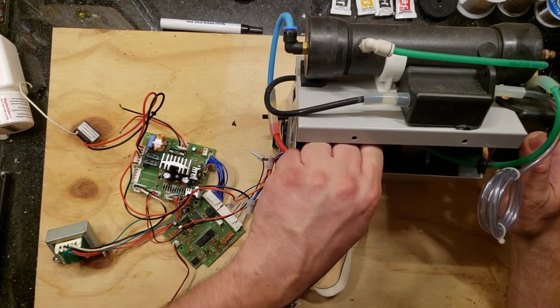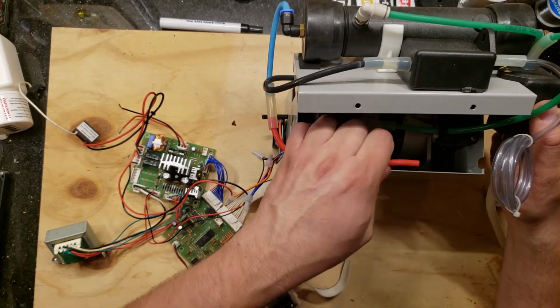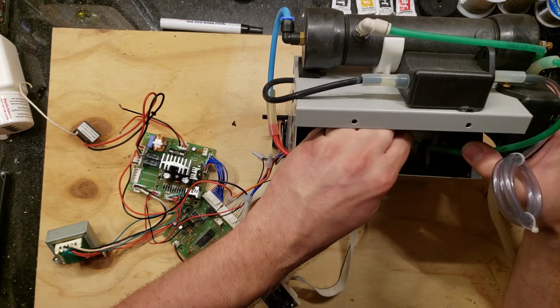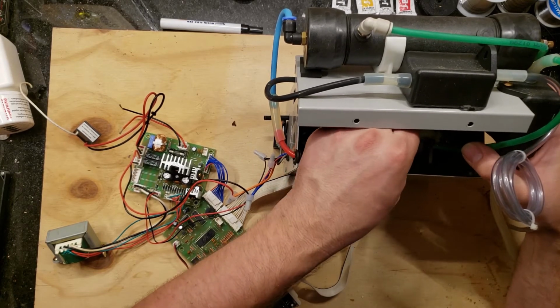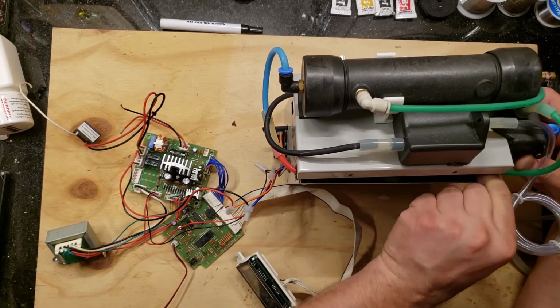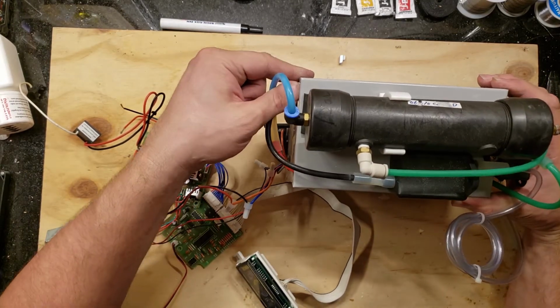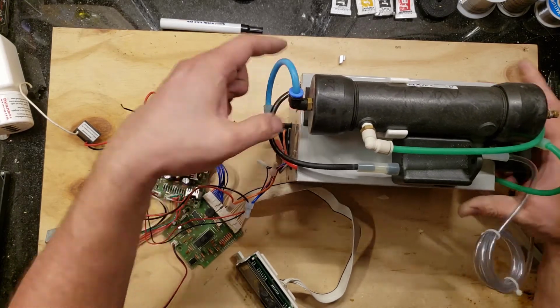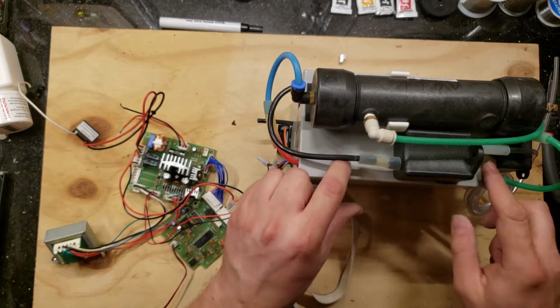Okay, so this did fall out of one of the sides of the compressor, so it looks like it's a dual compressor. So it could be that it is producing air that's enriched with oxygen, but because of this, it wasn't making it out. So let's fix this real quick, and let's see if we can get some noticeable oxygen output of this thing. Okay. Let's bolt this back down.